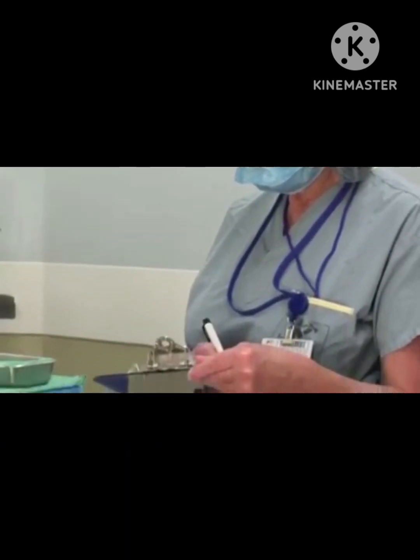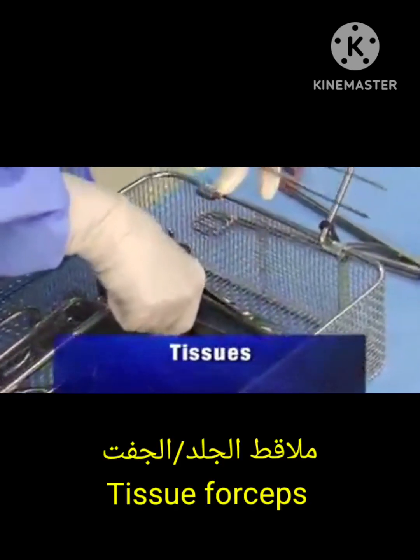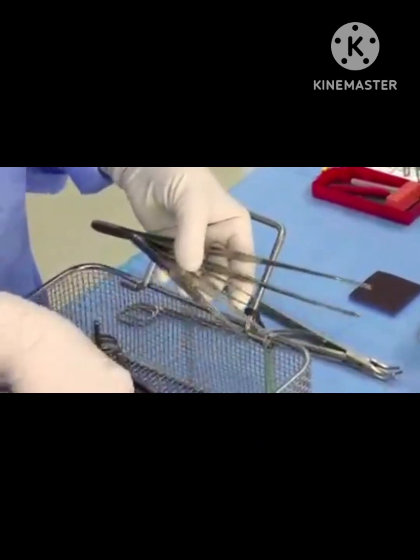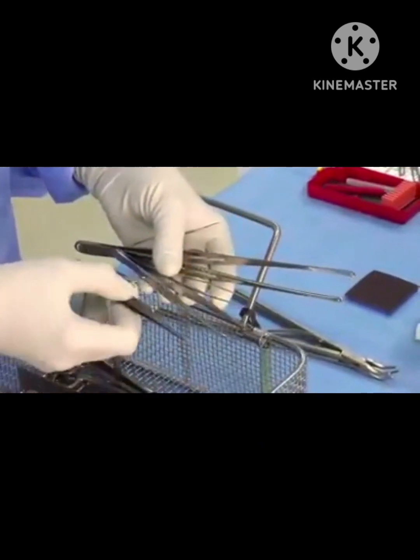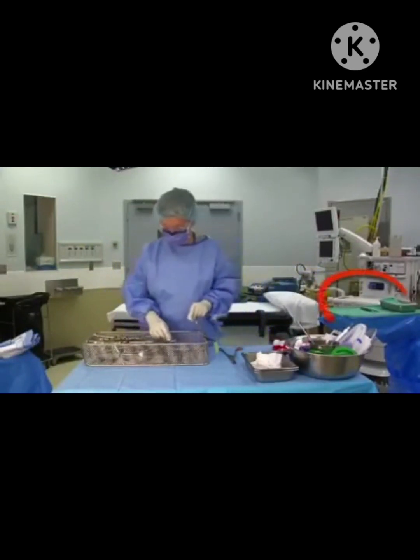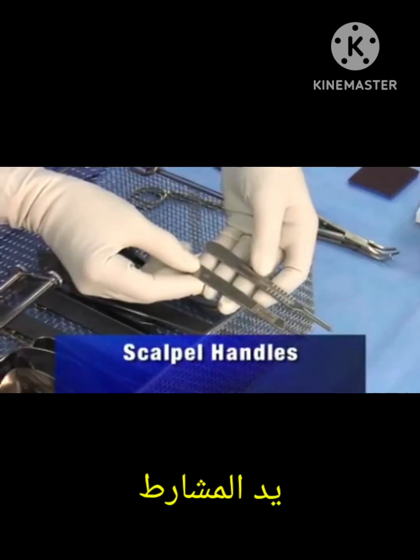Some instruments, such as the pool abdominal suction tip, have multiple pieces — show and count each piece separately. At the conclusion of surgery, you will need to count all parts out. Tissue forceps and scissors used for the initial incision and opening can be put directly onto the mayo tray.